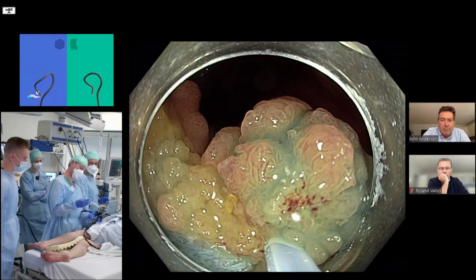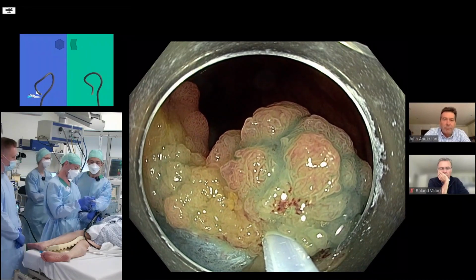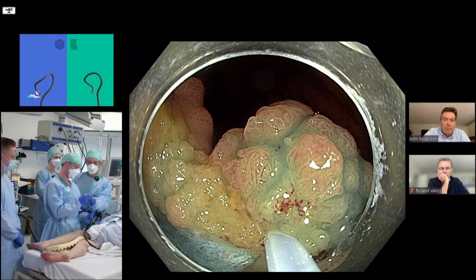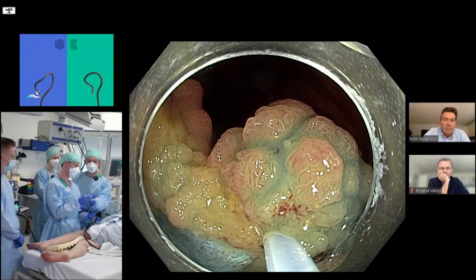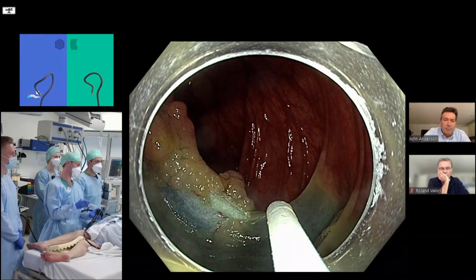So now practice this time. Do not let me hear a click, right? So get this here, get it like that, and then just focus on that. I will not close my hand. Yeah. Just let the diathermy do it. Right. I wasn't back.